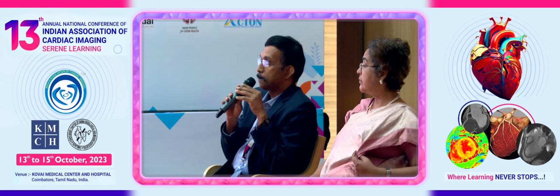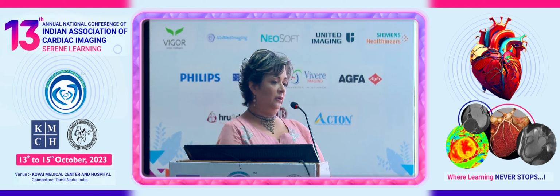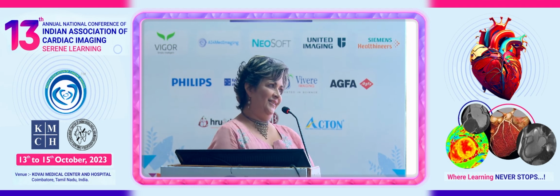experience? Well, to follow up the patients with the parametrics, even with the LGE sequences, it depends on reproducibility in your hospital.